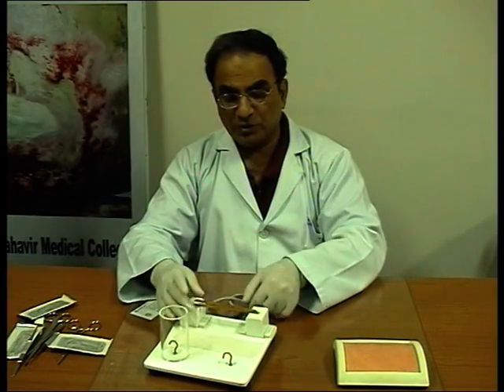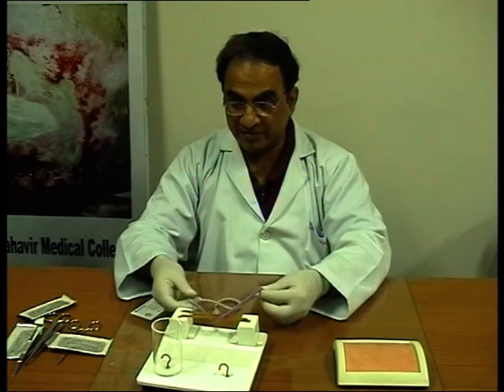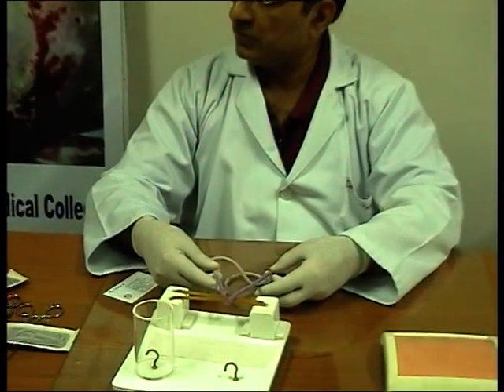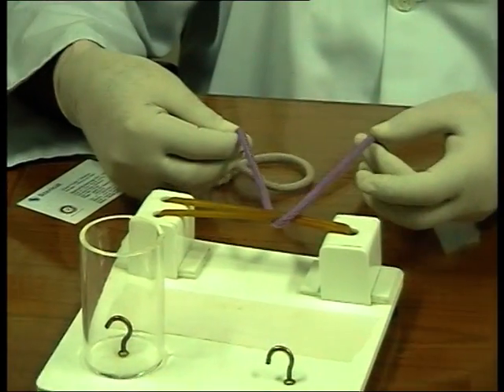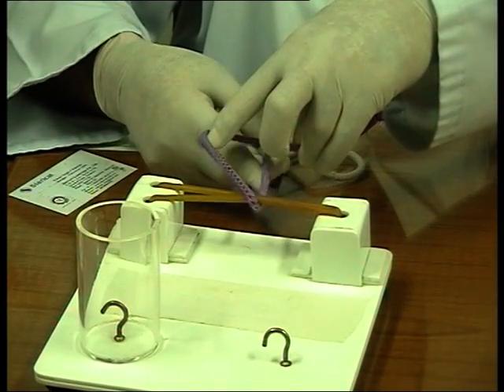Now, you can do the same with the left hand. You can keep on practicing. But with the left hand, how do you do it? The same way. I'll hold the short end in my left hand. The short end will be in my left hand now. No problem. Now, I'll draw this out like the mirror image of 4.